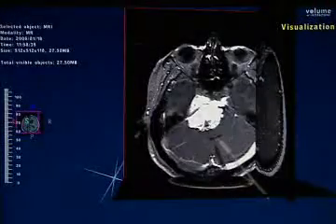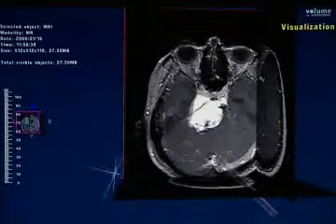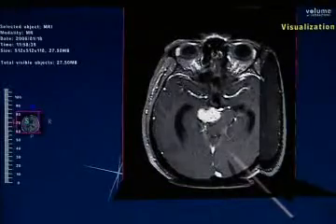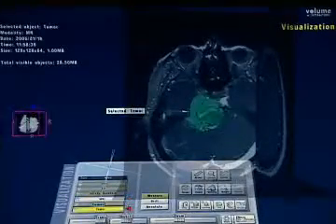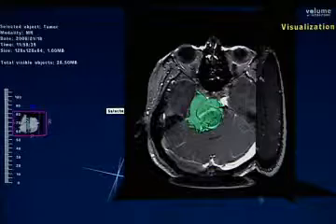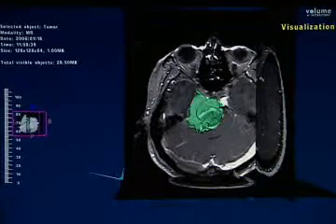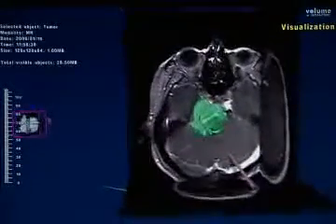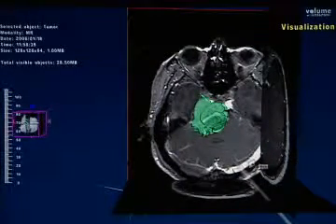You can scroll up and down just looking at anatomy, and this is really trying to sync the 2D images that we normally see to what we can translate that mental picture into in the operating room. But what we thought this system was useful for, from the uninitiated perspective, would certainly be virtual reality and 3D visualization, to help crystallize and conceptualize not only abnormalities in function and anatomy, but really the structural distortion that this tumor causes in this particular case.